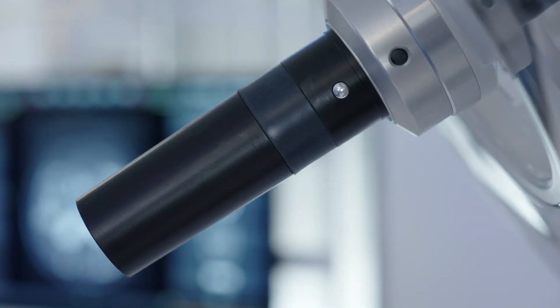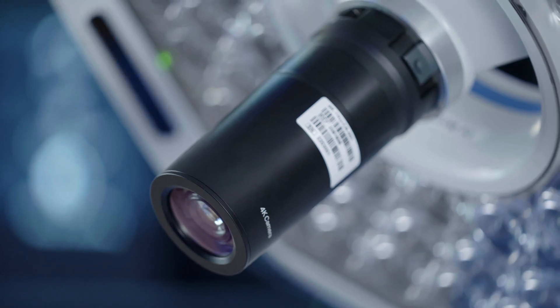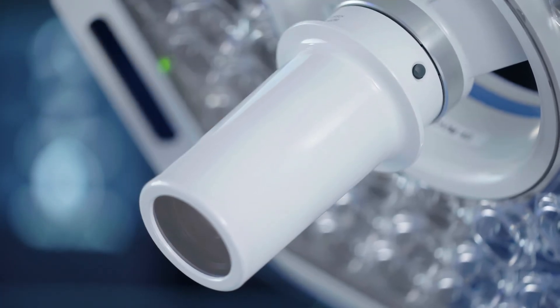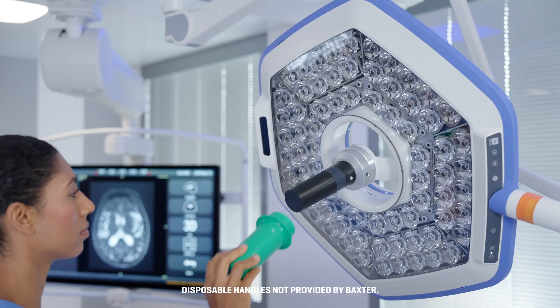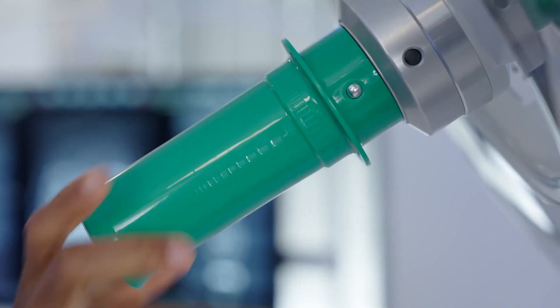Both sterilizable and disposable covers are available. When using sterilizable covers, slip the cover on over the handle and twist until it is locked into place. For disposable cover adapters, slip the adapter on and twist until it locks into place.